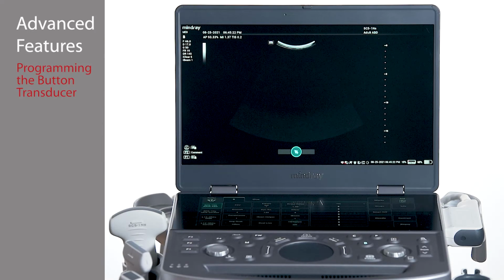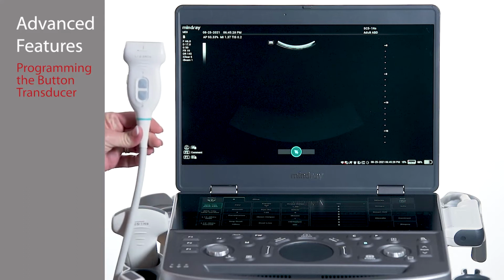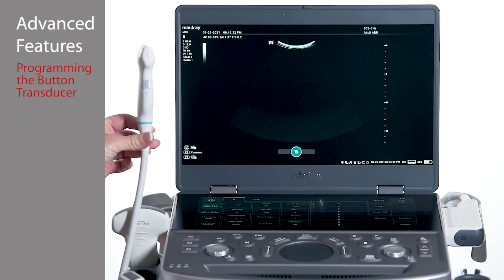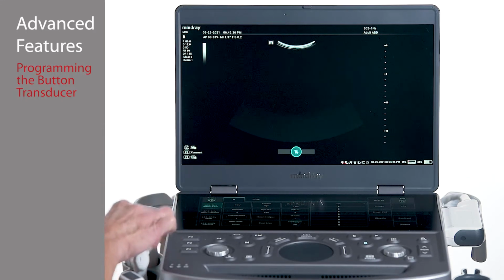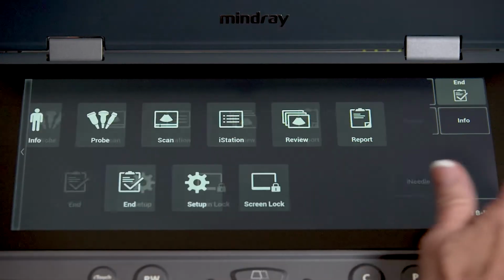Programming the button transducer. The L12-3 RCS and L12-3 VNS linear ultrasound transducers allow for operational functions to be programmed to the buttons. There are 3 button controls, 2 on the face and 1 on the side of the transducer, that can be programmed for multiple functions if desired.